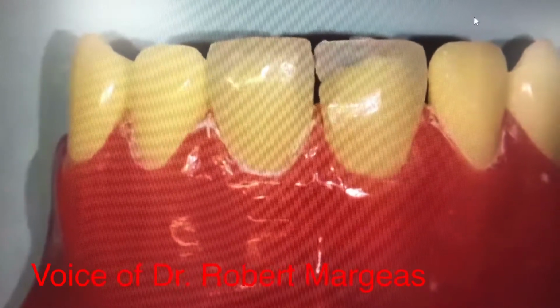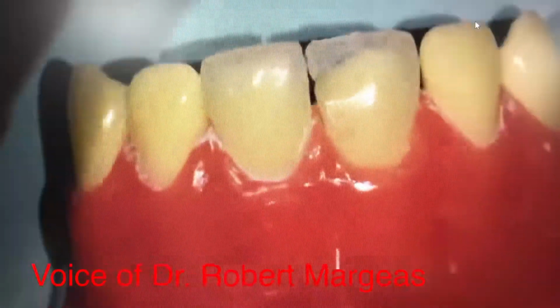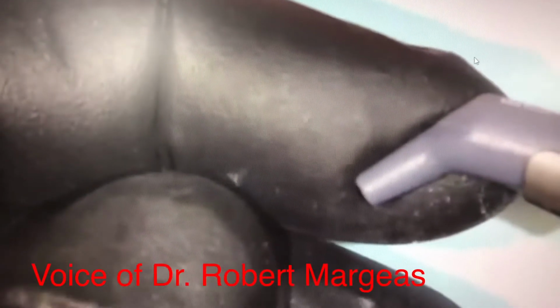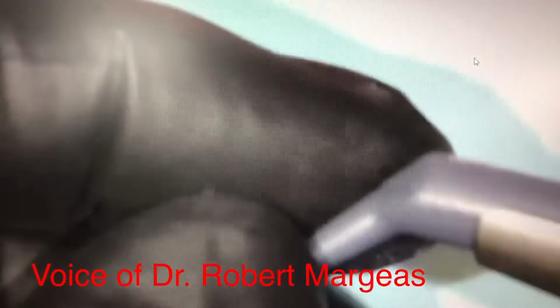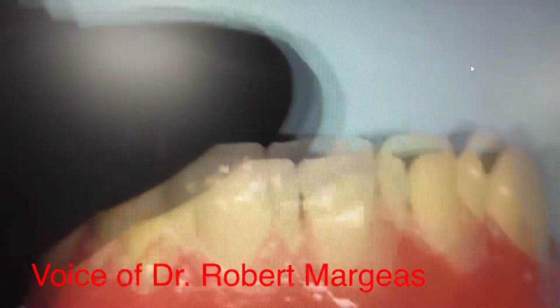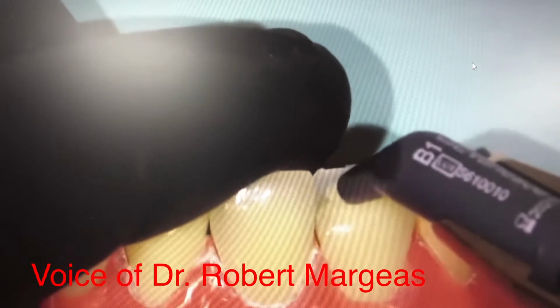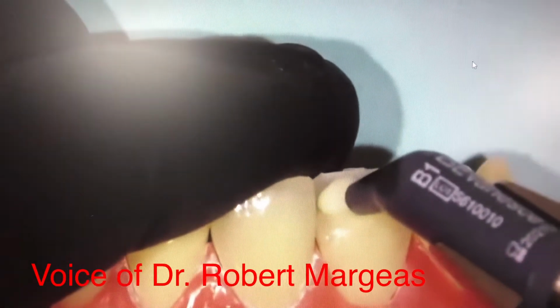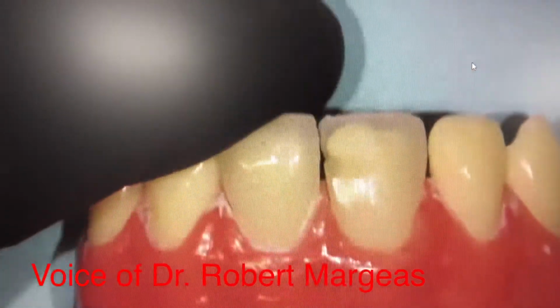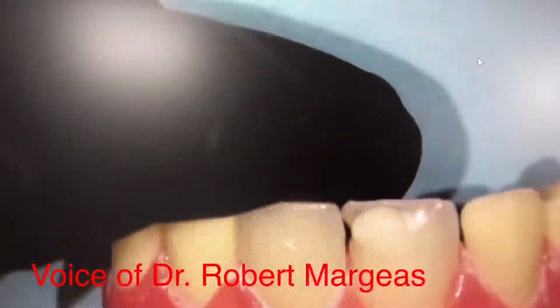Now pay particular attention to this, because if you don't do this correctly, you're not going to be able to block your bevel. So this is what I mean by taking like a little piece off. As it comes out, what I'm going to do is take the first little bit off like that. And I'm going to come here and I'm going to place the material onto the bevel. Okay, like that. I put on more than I need. And then what I'm going to do is blend this into the bevel and create my dentinal lobes.